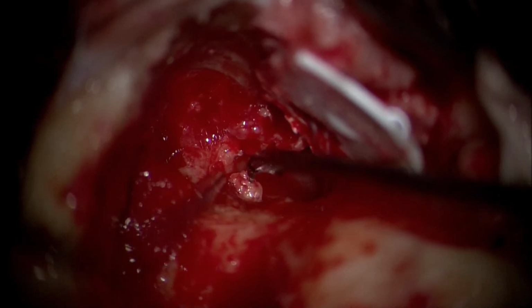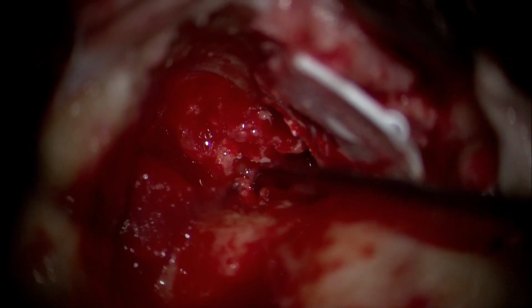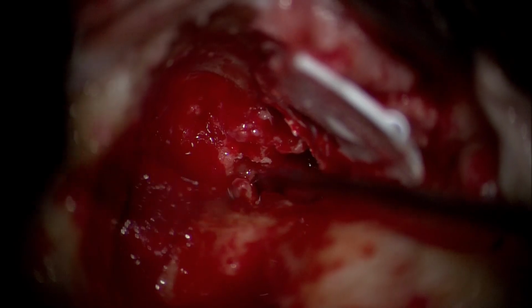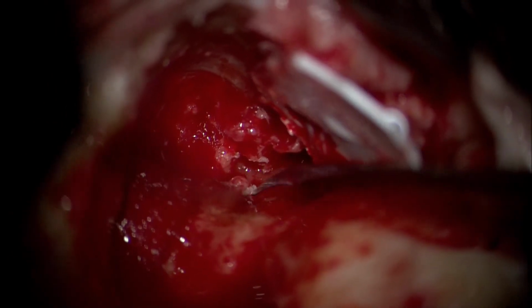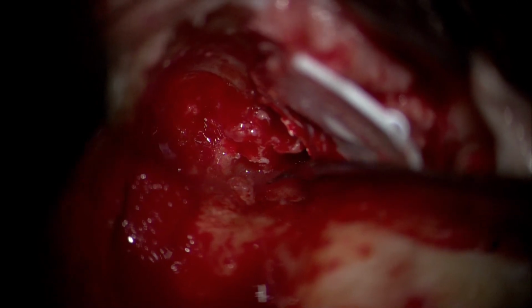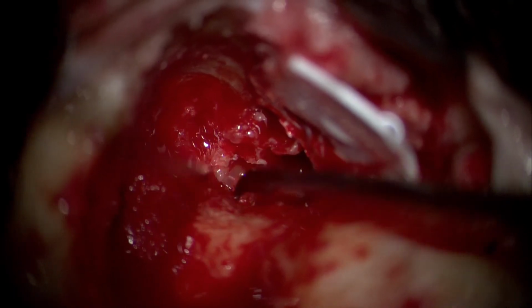And in patients where hearing is intact, one should try to minimize the stapes movement as much as possible. In patients with severe or profound deafness, one could either ablate the stapes using a carbon dioxide laser, or sometimes even resect the stapes using sharp instrumentation. But often we do not want to contaminate the inner ear with the diseased mucosa or the epithelium. So, as a primary surgery, all effort must be made to clear the disease from this intact stapes.